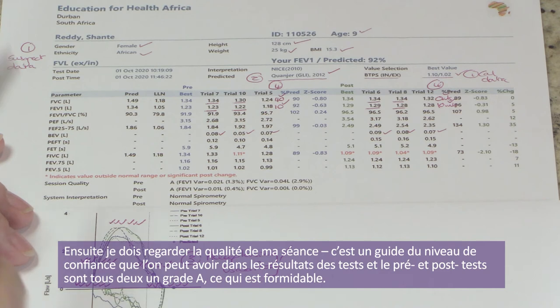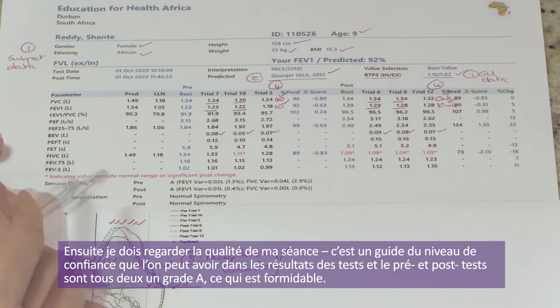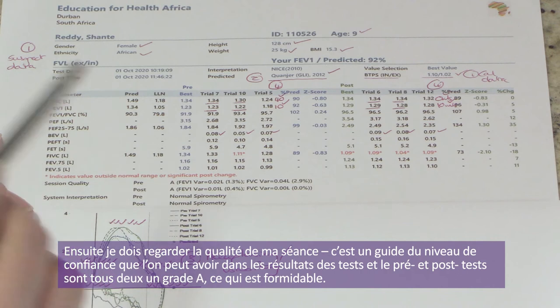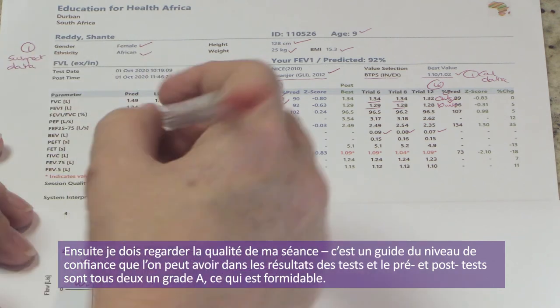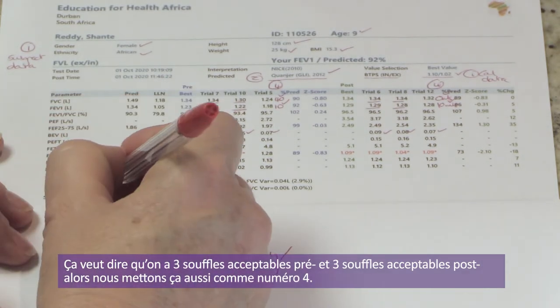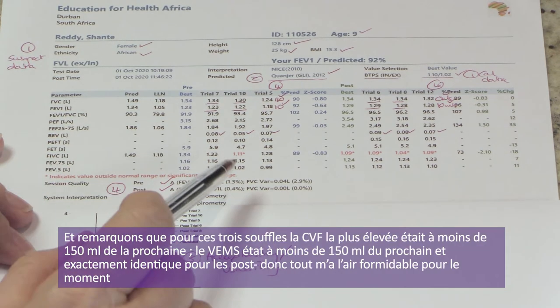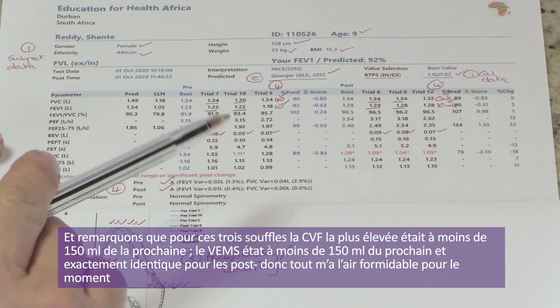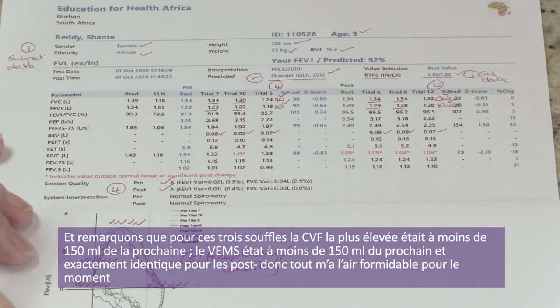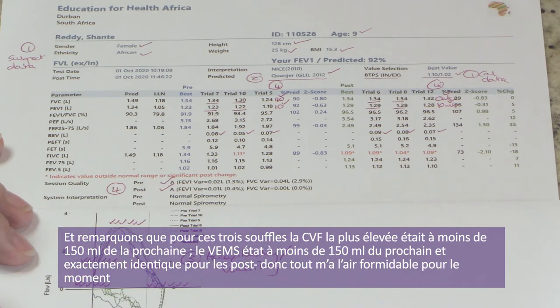Looking at session quality — this is guidance on how much confidence we can have in the quality of the test result. Both pre and post tests are grade A, which is wonderful. That means we've got three acceptable blows pre and three acceptable blows post, with the highest FEV1 within 150 mils of the next highest for both pre and post.